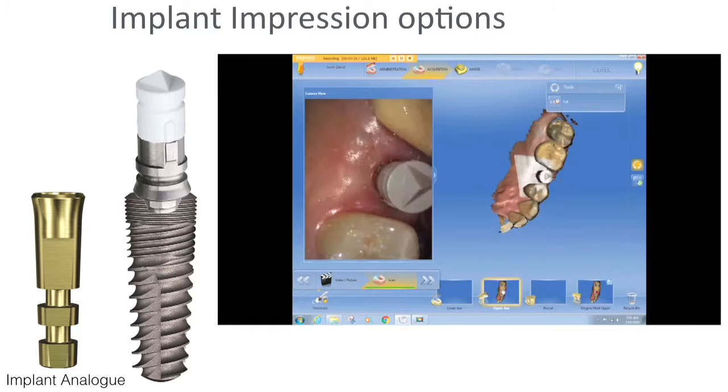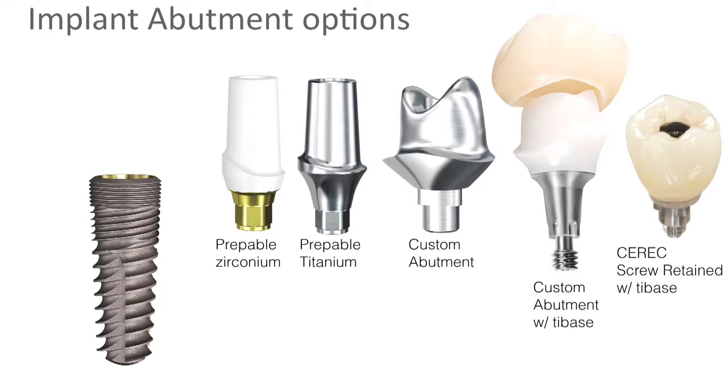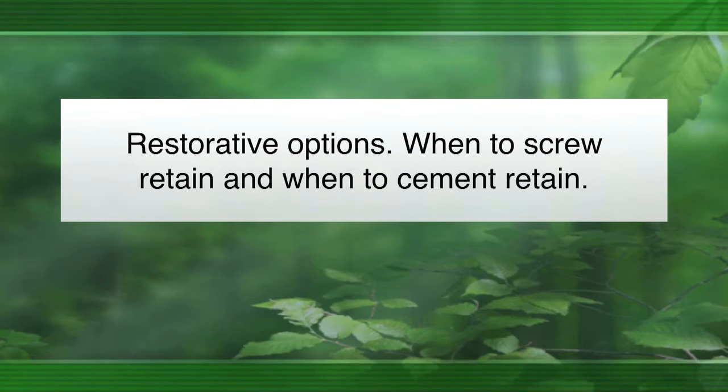Simple, easy. Now that we have that, we can create your crown on top of it. Implant abutment options. Now that you have your implant impression done, you can do a prefabbed abutment or other things. So here are the options you have.